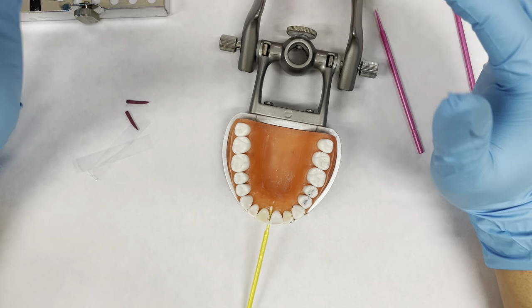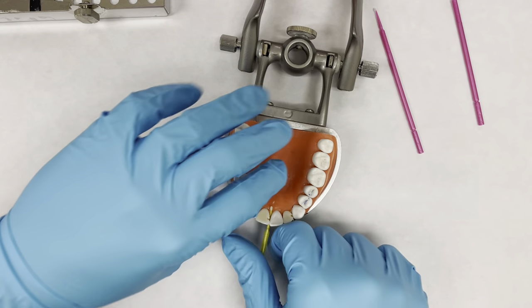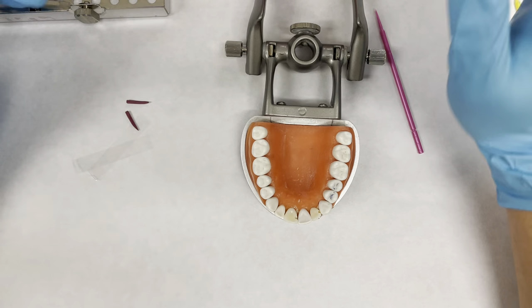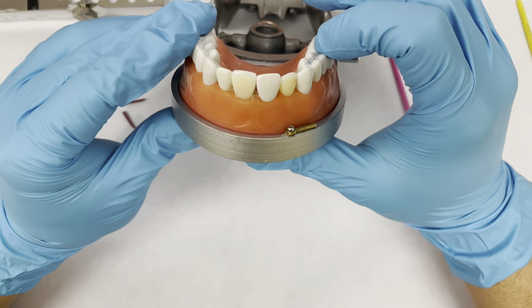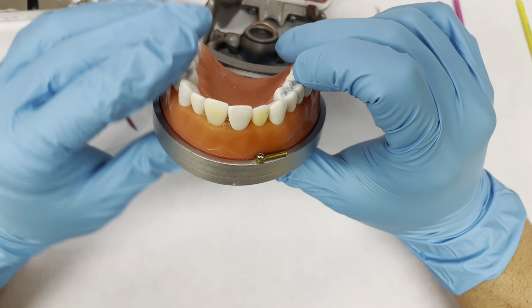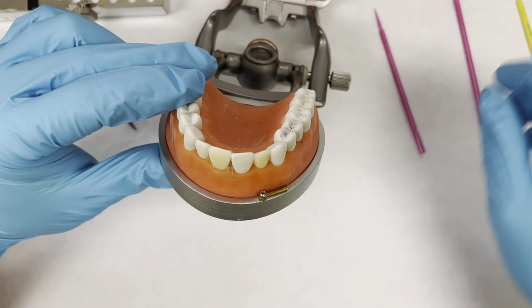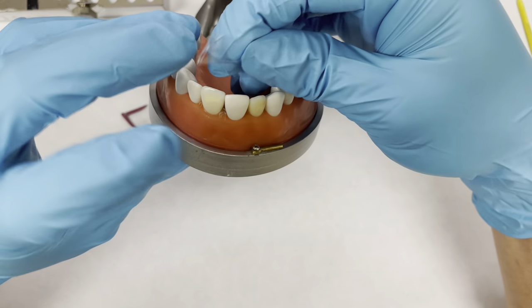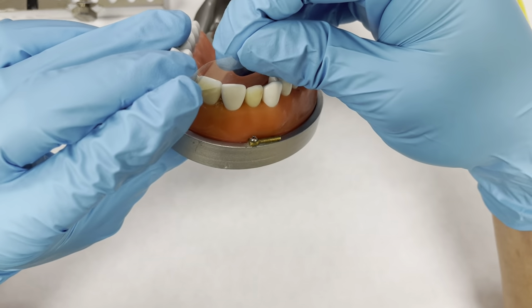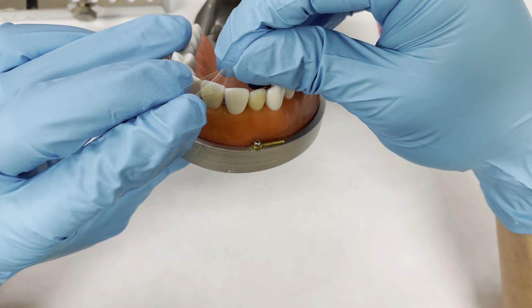This video is on the restorative portion of the CDCA. When you're working with your typodont, you're going to notice that the contacts are very tight. One of the easiest ways to get around that is going to be by wedging — pre-wedging — before you get your matrix or your rubber dam.